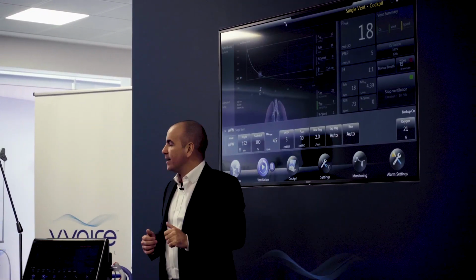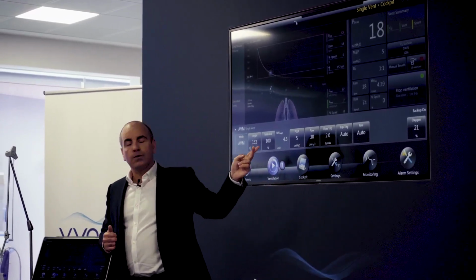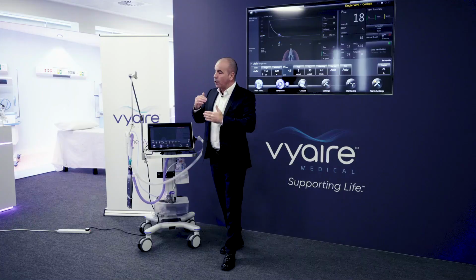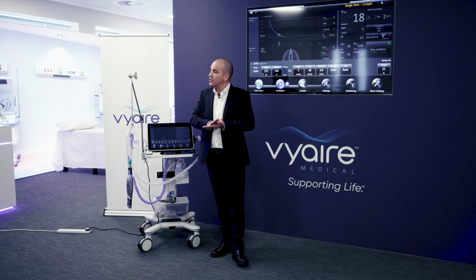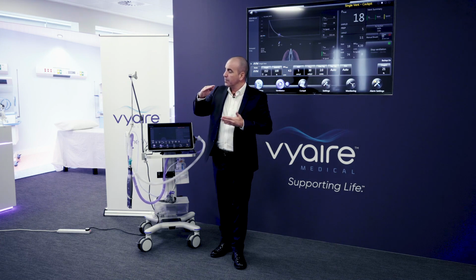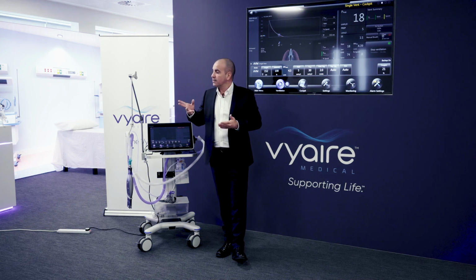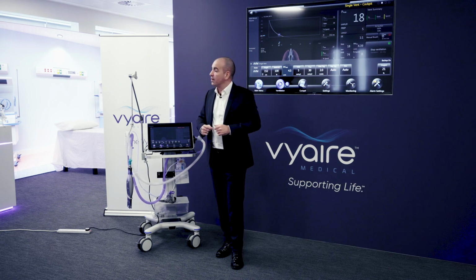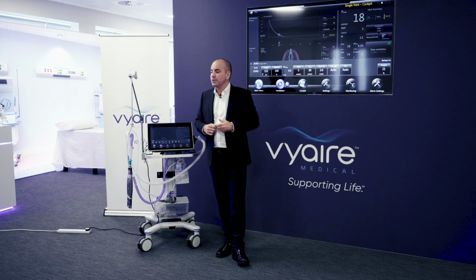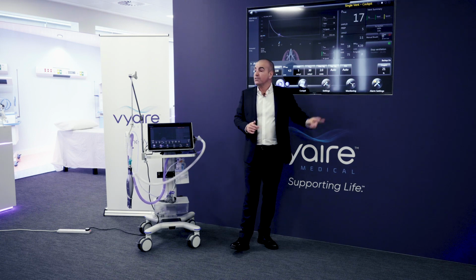Similarly, we have auto rise. These are selling features that we go to market with. With auto rise, going from our low pressure to our high pressure, as soon as the gate's opened, the foot's on the turbo and it goes as fast as possible to get that breath into the patient, but without overshooting. You don't want that. So it's as fast as possible from the outset, and then it slows down as it reaches the top so that you don't overshoot your target. So yes, we can accommodate the patient and keep them more comfortable. They're two features that we would want to get into tenders.